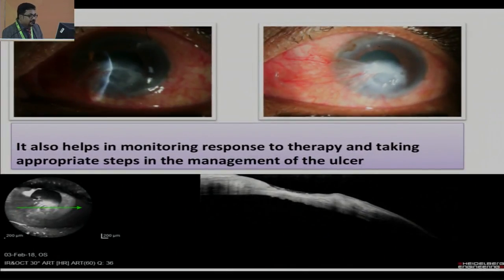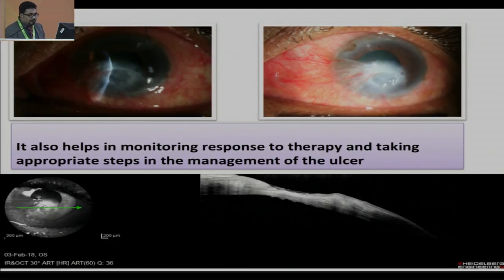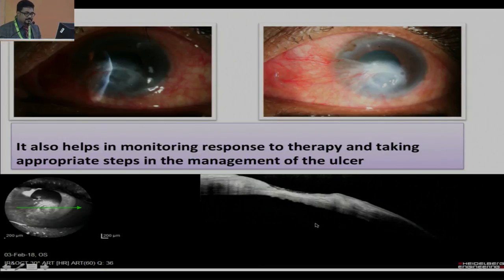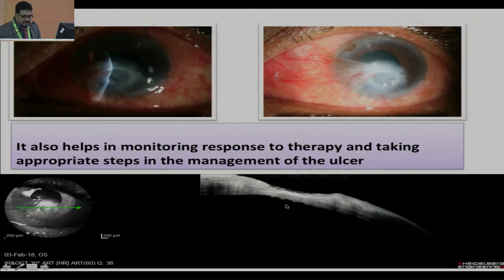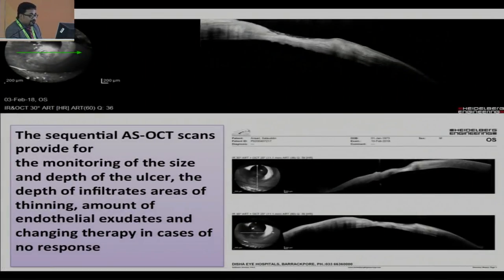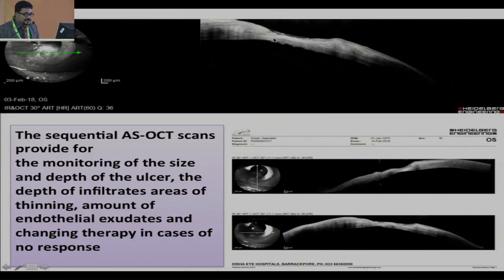Another patient was empirically treated with antimicrobials, was not healing, and came to me after three weeks. On OCT I could see dense, large keratic precipitates, which gave the clue to the diagnosis of HSV stromal keratitis — something you can see on SOCT only. Sequential SOCT scans provide monitoring of the size and depth of the ulcer, depth of infiltrates, areas of thinning, amount of endothelial exudates, and guide changes in therapy in cases of no response. After putting antivirals, the KPs resolved and the patient improved.